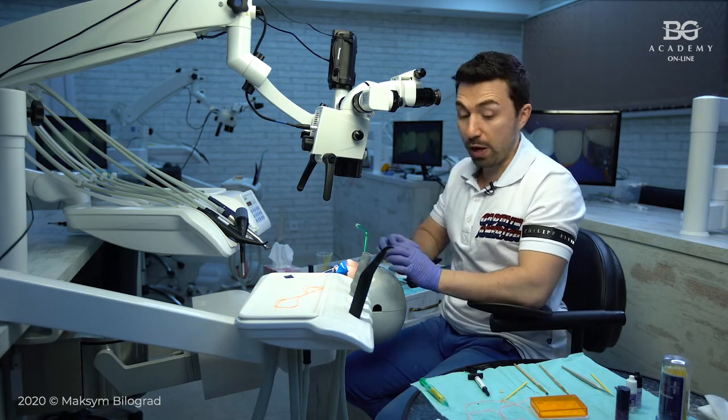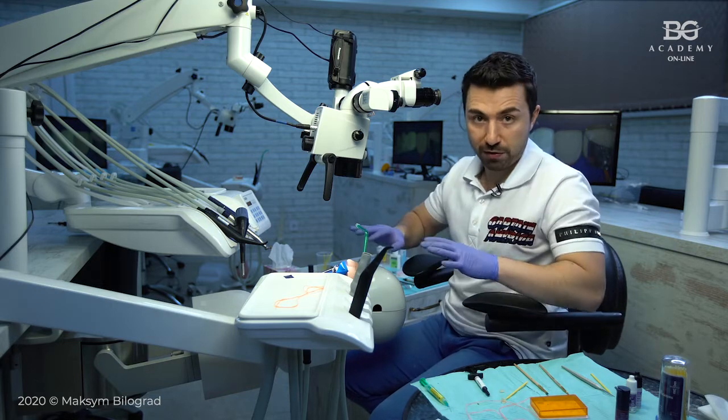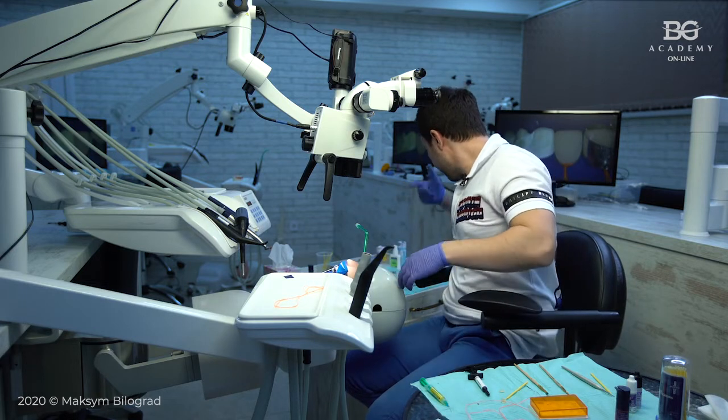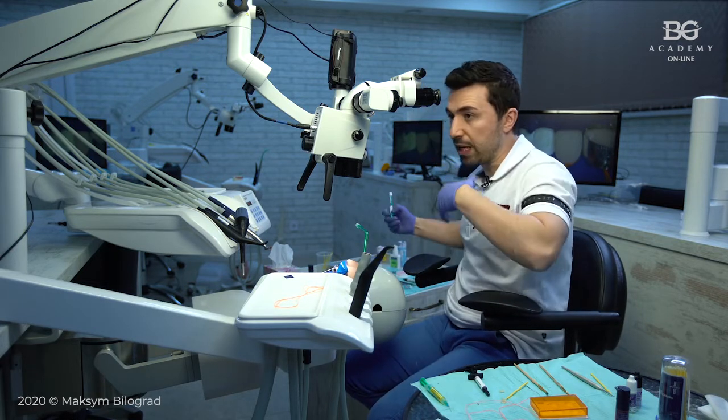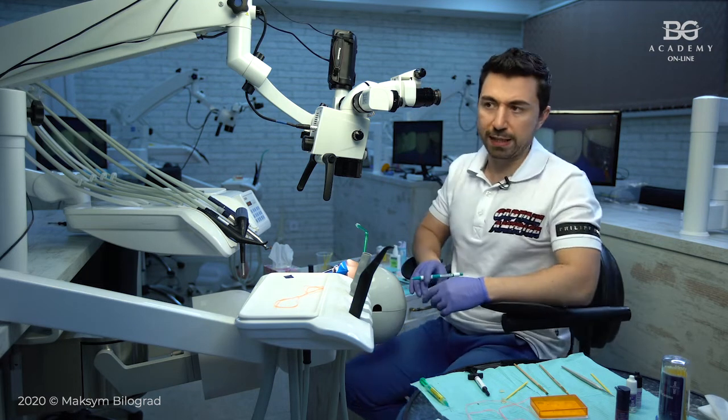But if we have dentin exposed? Let's do another scenario. Let's forget everything that I did before. We will now simulate, we will imitate case when you have, for example, here, exposed dentin, okay?